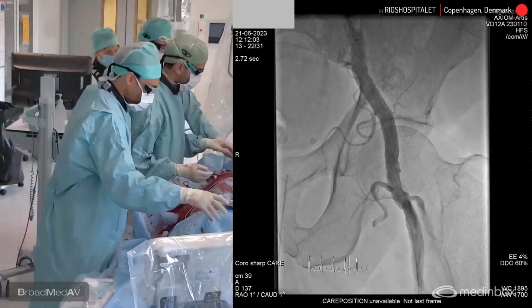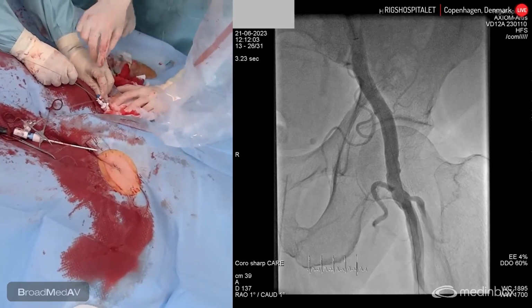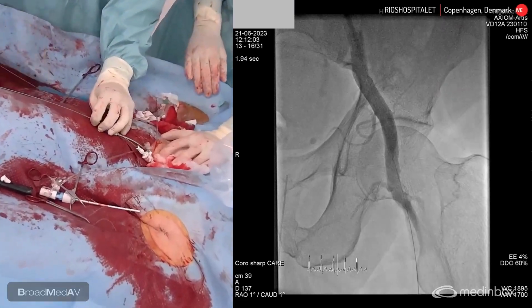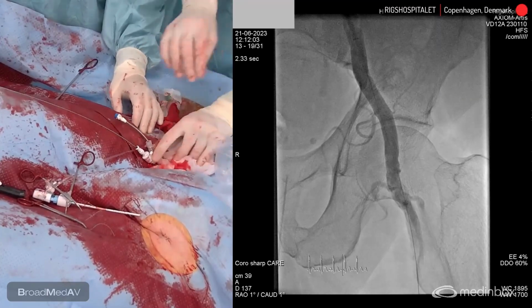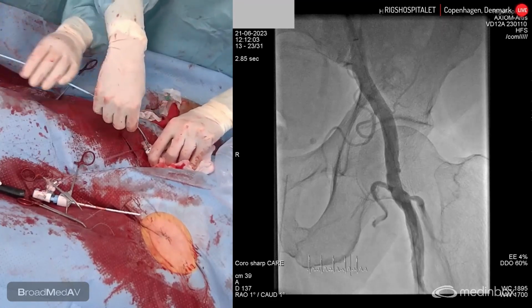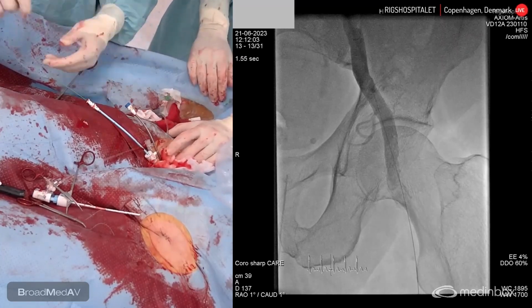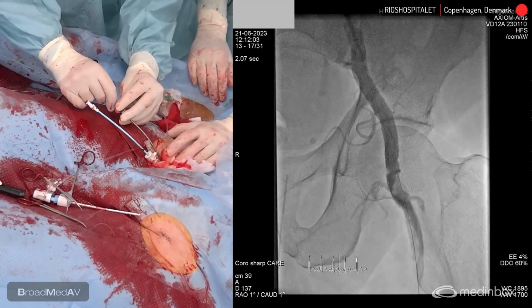And now that's the main axis. Now we only have this axis, but we have an additional axis. So first, let's get it from a crossover position. Now this out, and then you just put in, what do we do? Just a J wire, I think, just a classical J. I'll leave it in because it bleeds. No, just put the J. This J wire is fine.